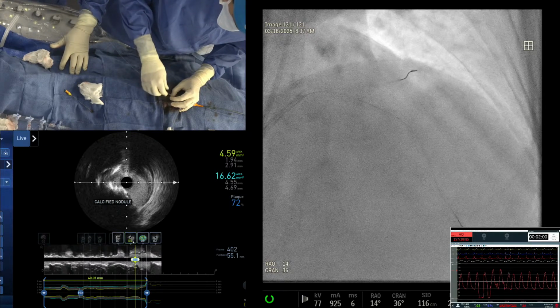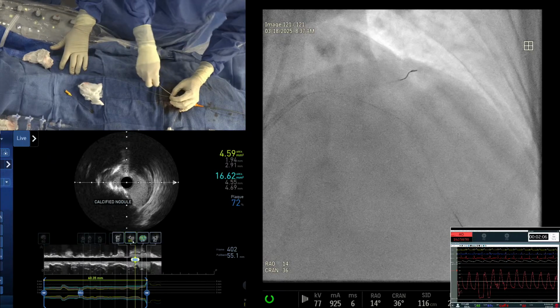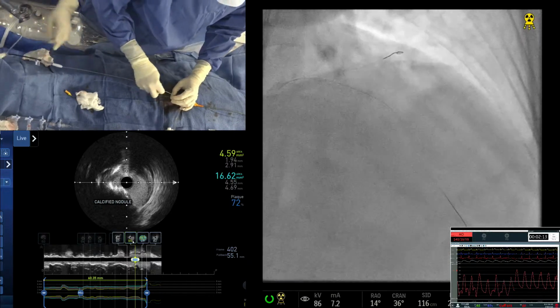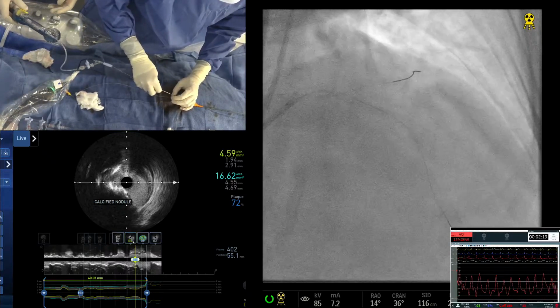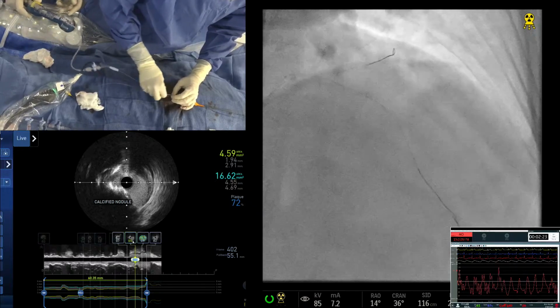That high pressure, make room for it. That is 54% even in the DISRUPT CAD 3, which was not that complex. They used a 54% time. They had to do a pre-dilatation. So there is nothing wrong in that, in this particular case. I'll just go with the balloon which we have. In real life situations, I can tell you it's probably even more than that 54%.